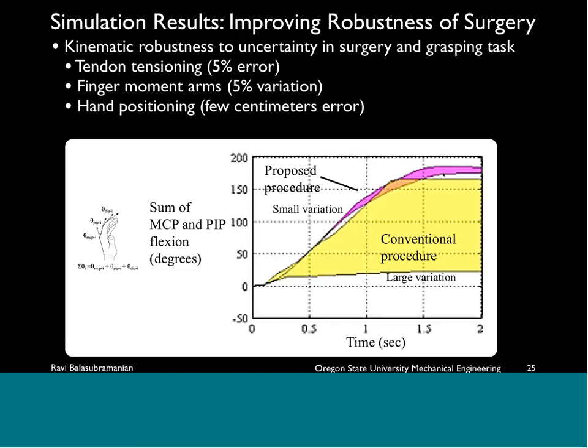So what this means is that for a patient after the surgery, it's just not clear after the suture-based procedure how much the fingers actually have to flex. And so this can make it hard for the person to relearn how to use the muscle to perform grasping tasks. Whereas in the pulley-based or the seesaw mechanism-based procedure, it leads to very small variation in joint angles.